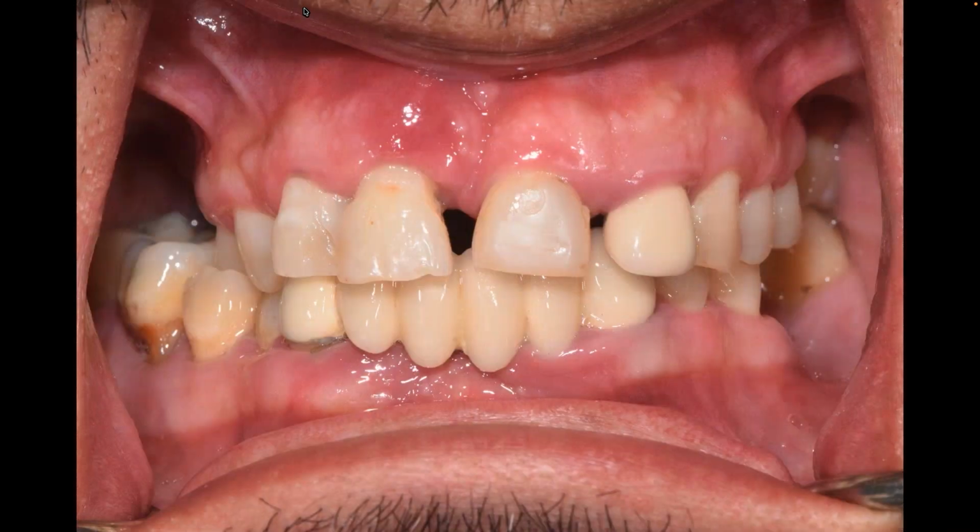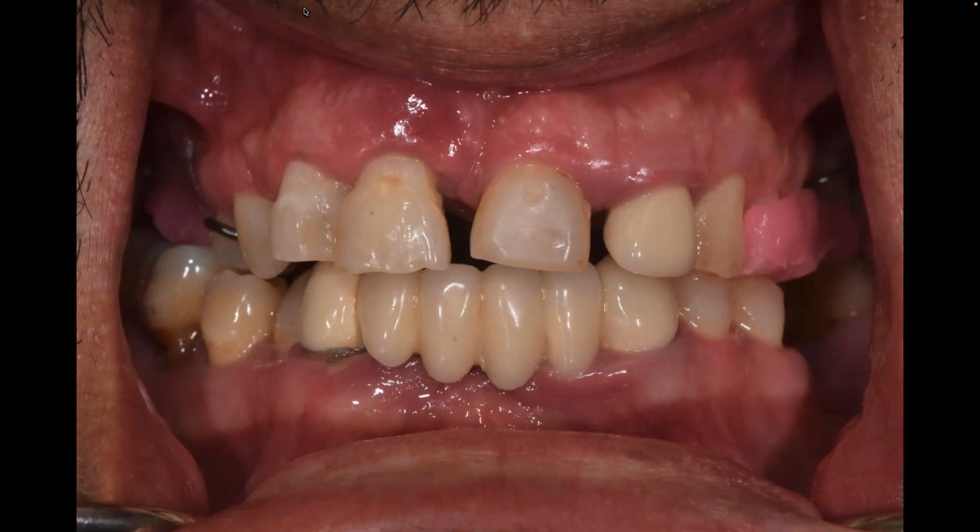If I make my immediate denture in this position, once the teeth come out, the patient's not going to be in this position anymore. Physiologically, the muscle memory will be wiped and the patient will go into CR. The patient will close in CR. So now the patient will close in this position, which means my bite is going to be way off. It's going to be in a totally different zip code.